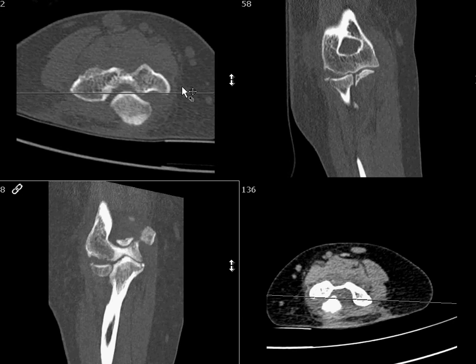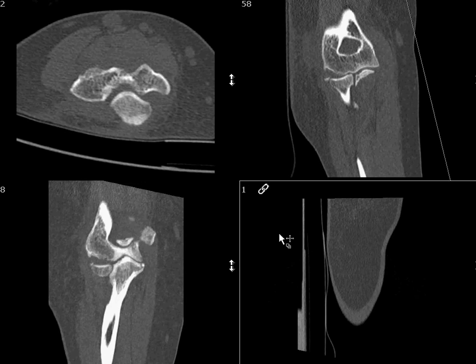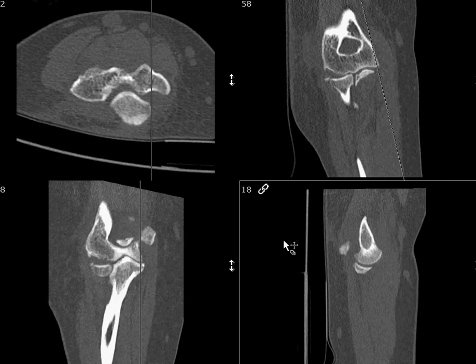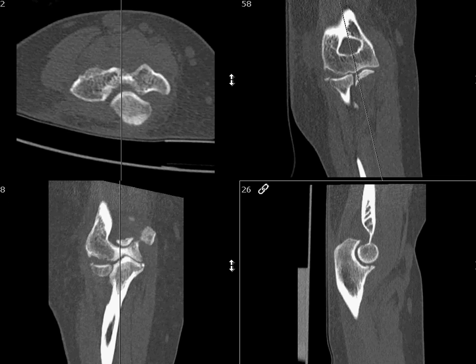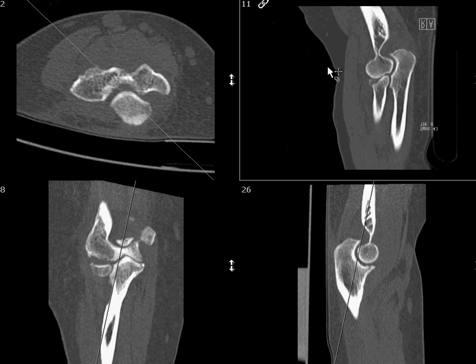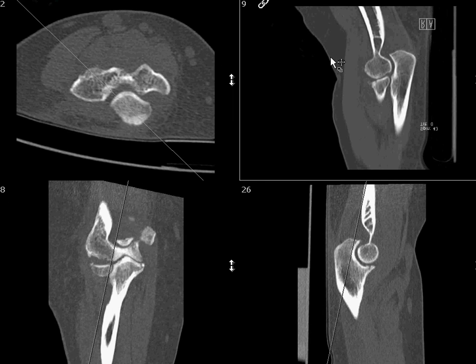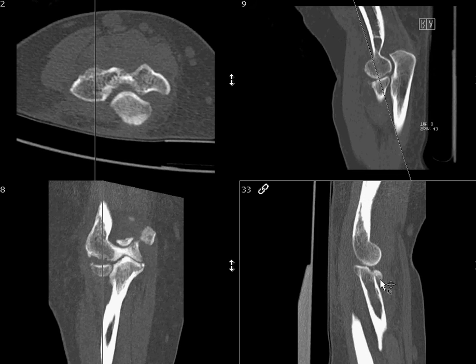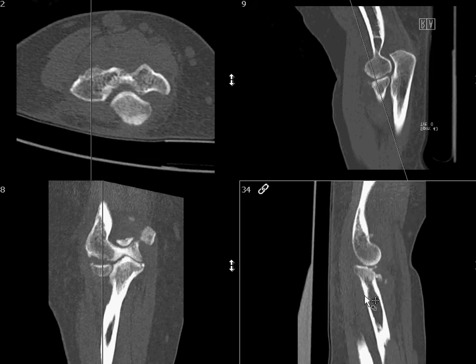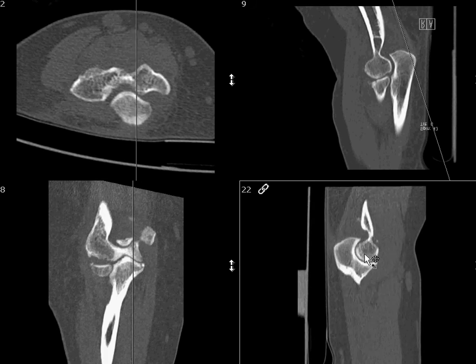Similarly, the sagittal is done orthogonal to that. Compare that to the original sagittal that was made — it's flipped around maybe, but you can see the radiocapitellar joint and evaluate this fracture very well. And then you can see the ulnohumeral joint very well like that, whereas on this other view it's all angled and skewed.